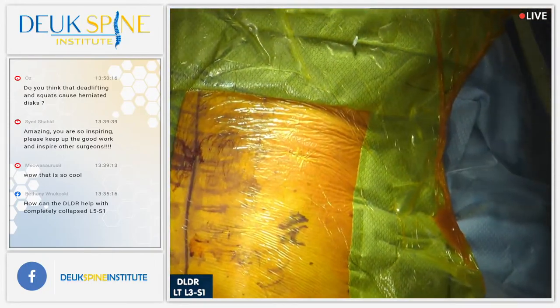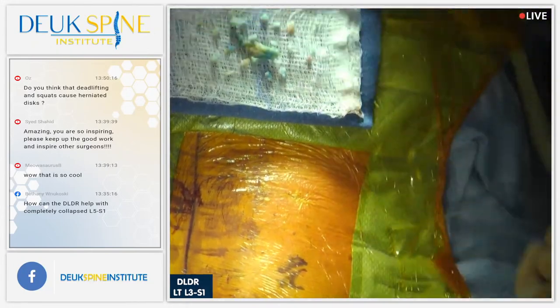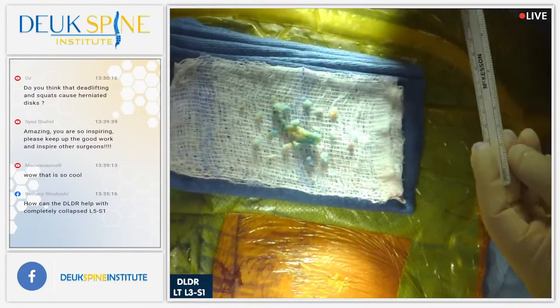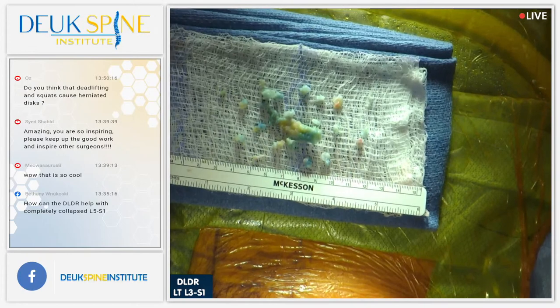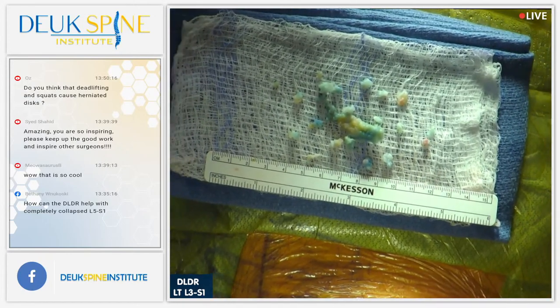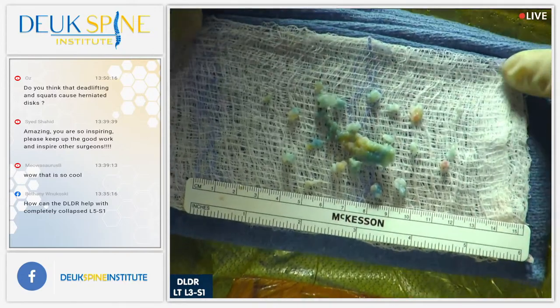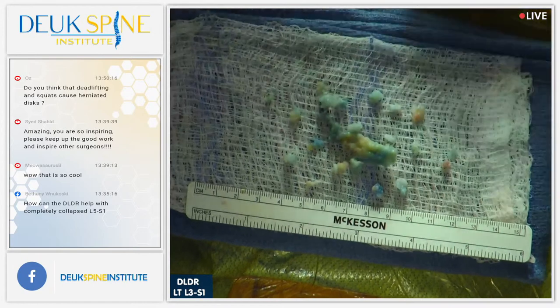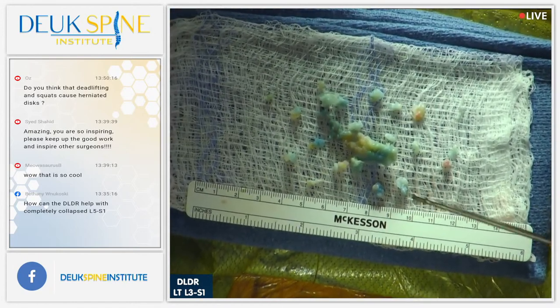We're going to show you the herniations. Thank you. Oscar's done a beautiful job. Can you see all these? Yes, we do. 30, I think. 30 pieces he counted. And there's more out here on the blue towels. You guys see all this, Henry? Yes. All right, Henry, this is the picture I want you to get and send me also for the article.